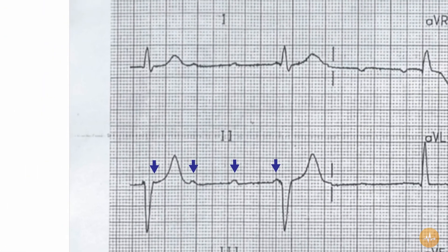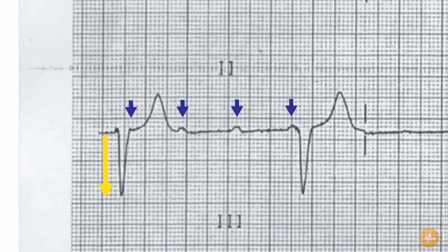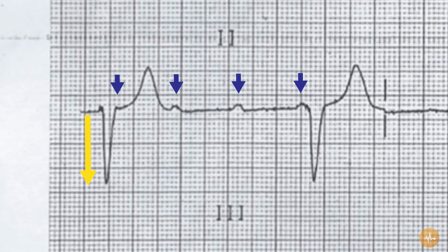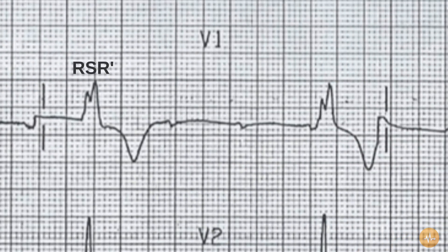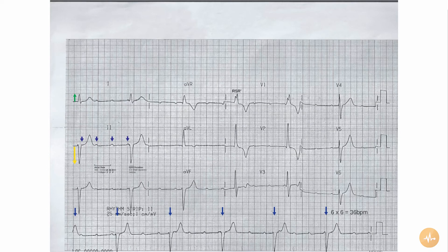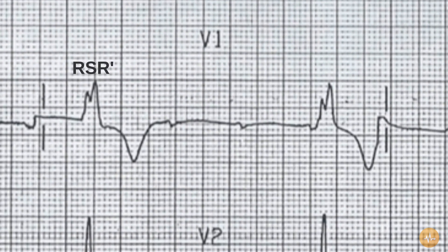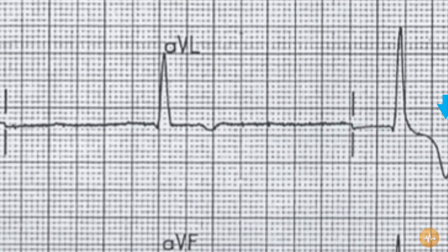The axis is deviated to the left with an up-going complex in lead 1 and a down-going complex in lead 2. The P waves are normal in morphology with a fast atrial rate of approximately 110 beats per minute. The QRS complexes are borderline prolonged at 3.5 small squares with an RSR pattern in lead V1. The ST segments are isoelectric.